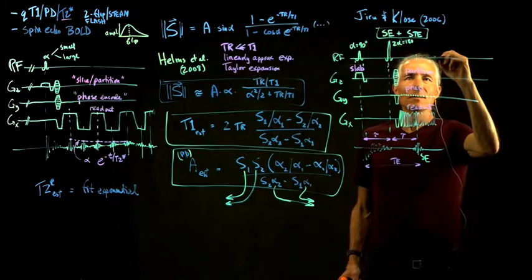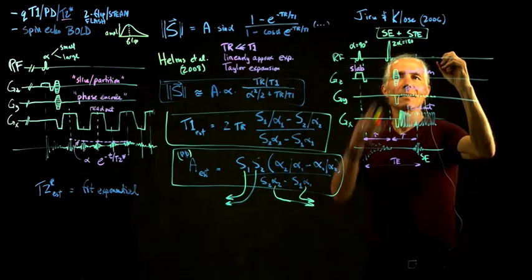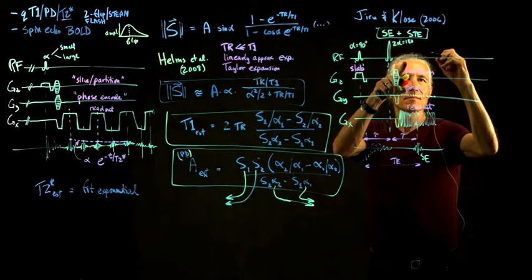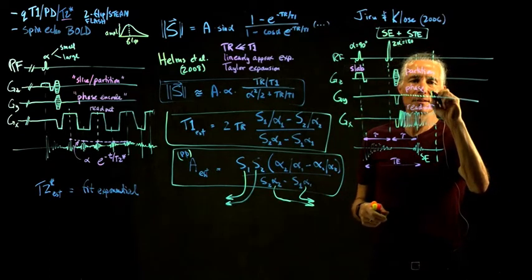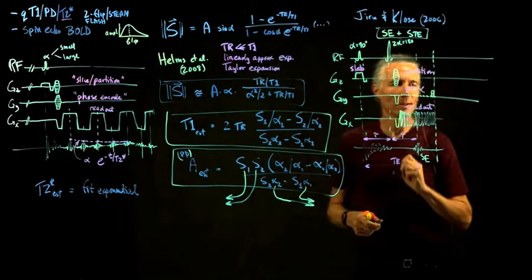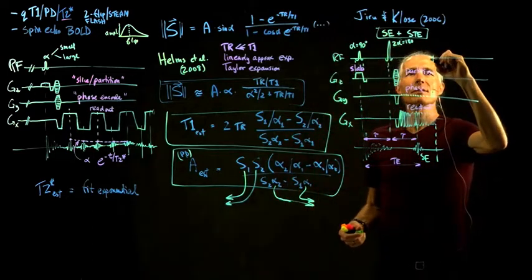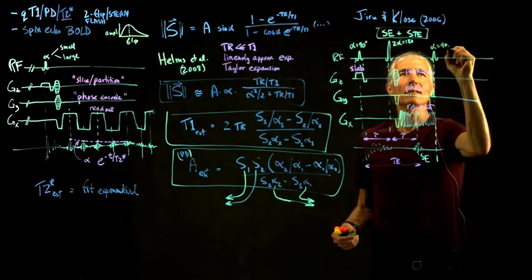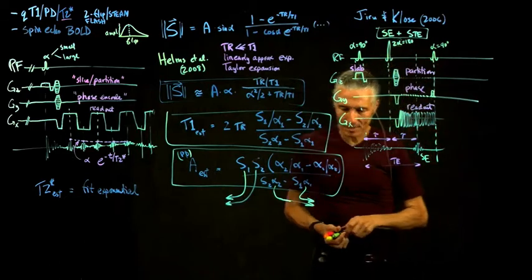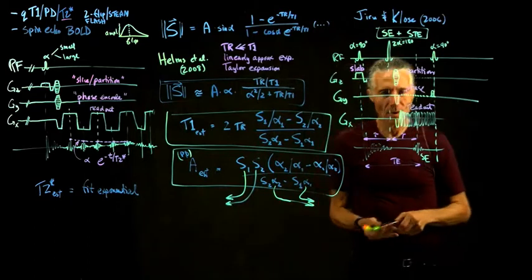So say we do another pulse right here, not exactly at tau, just after we finished. So we might do a spoiler there. Okay, so just after we finished, we do another pulse, and this pulse is again equal to alpha, say it's a 90 degree. So now what's going to happen is we'll get another echo, and where will that echo be?